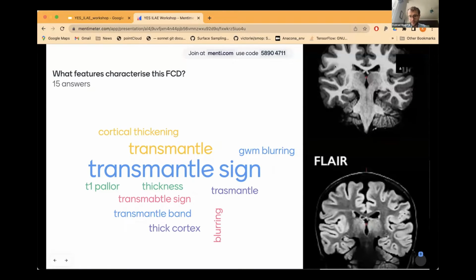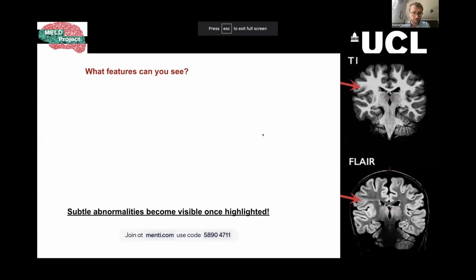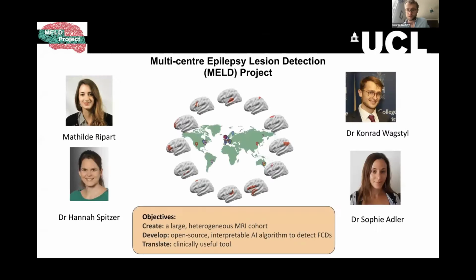And I think that the reason for going through this exercise is, one, I took you to the right section and this is a relatively visible FCD, but they're still subtle. But being taken to the right place is a useful first step, and knowing the features that you're looking for, that this looks like the features of an FCD, is also very useful. And those are two points just to make, because when we go on to talking about interpreting the outputs of the classifier, knowing what you're looking for is important. Okay, let's see what we get to. Done that. Yeah, so we've done the features.